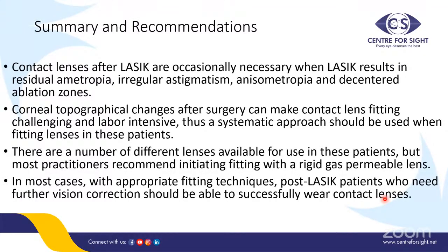So to summarize, contact lenses after LASIK are occasionally necessary when there is residual ametropia, irregular astigmatism, anisometropia, and decentered ablation zones. And corneal topography changes after surgery can make contact lens fitting challenging and labor intensive. However, when such patients are properly fitted for contact lenses, they may be extremely thankful, and it's almost a miracle for them. So it's definitely labor intensive, but good work can help with good outcomes.